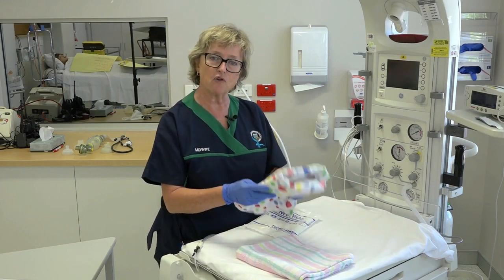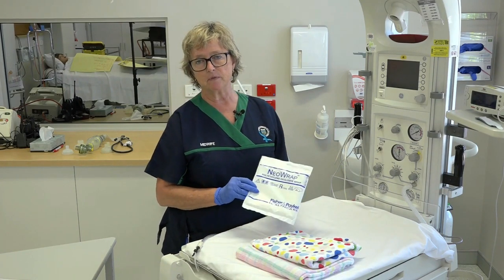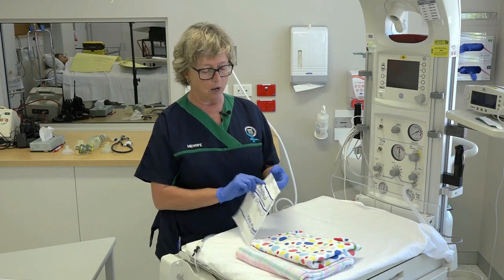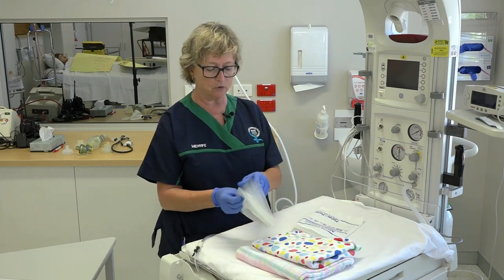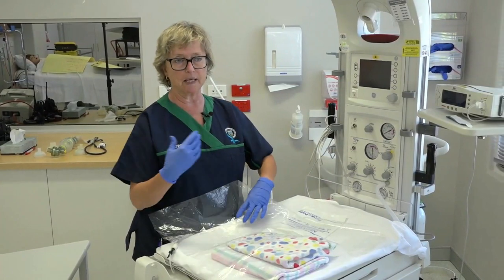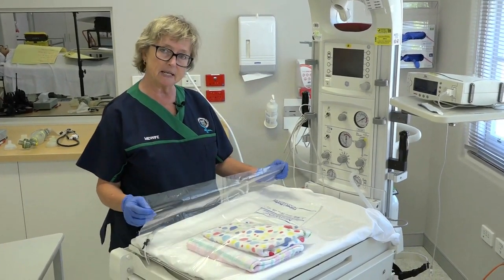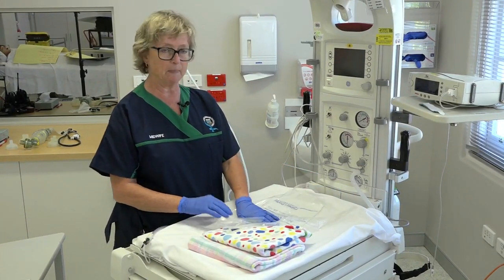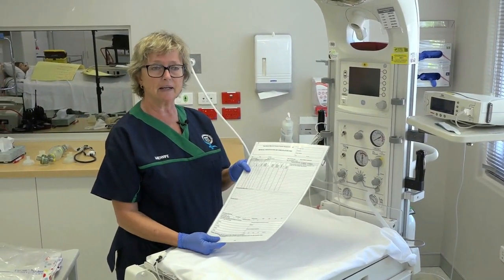In addition to the heater, we need pre-warmed wraps and something to dry the baby with, which can then be swapped for a dry wrap. For small or preterm babies — those less than 32 weeks gestational age or less than 1500 grams — we use plastic wraps. The baby is not dried but placed inside the wrap, which could be a poncho-type wrap or bubble wrap, while still wet, keeping the face outside. This acts like a greenhouse to keep the baby warm.